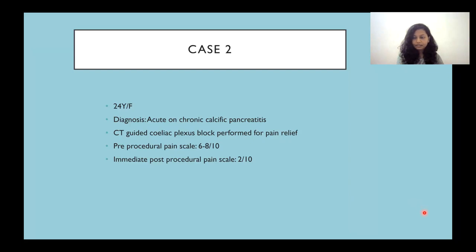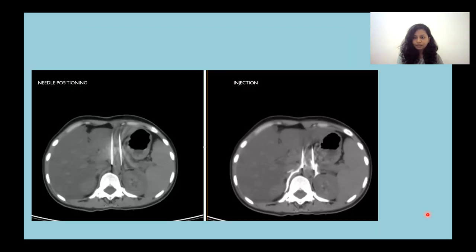Case 2 is a 24-year-old female with acute and chronic calcific pancreatitis. Pre-procedural pain was 6 to 8 out of 10, whereas immediate post-procedural pain was 2 out of 10. This image depicts needle positioning and the injection consequently.